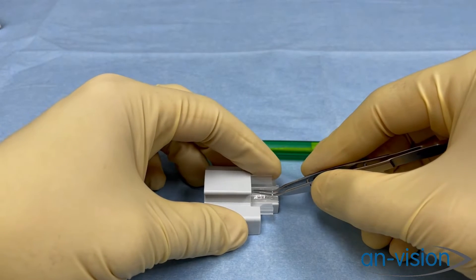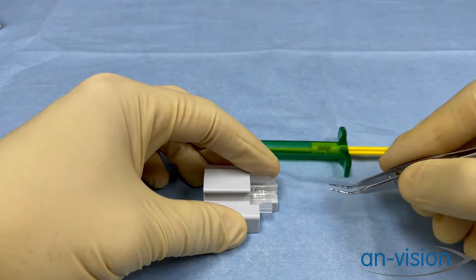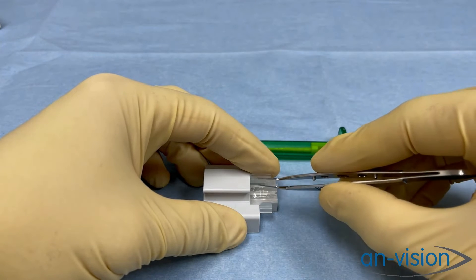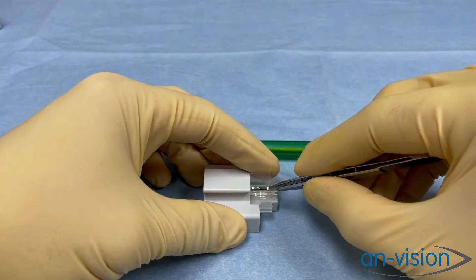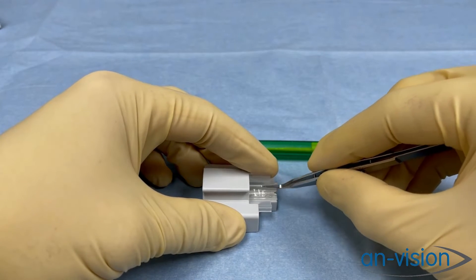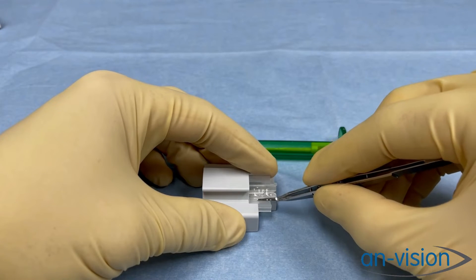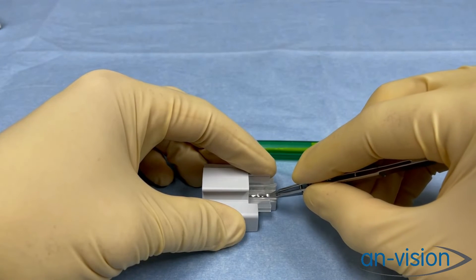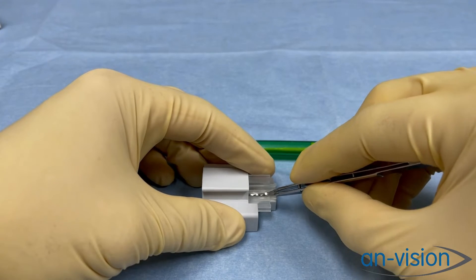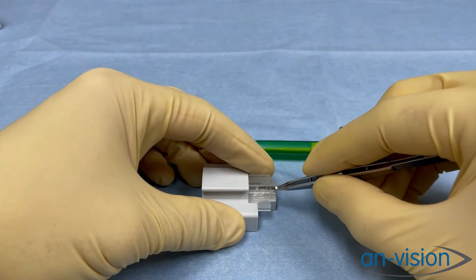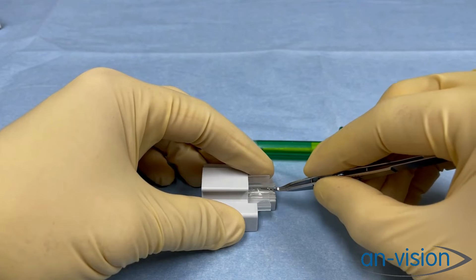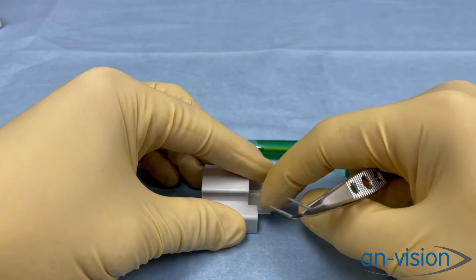At this point, we are able to close our forceps and gently tap the edges of the IOL, sliding down that plastic, making sure those haptics are trapped in the grooves that I mentioned and pointed out earlier.